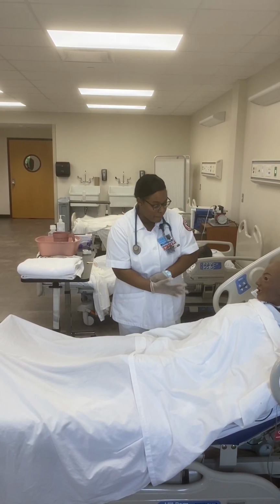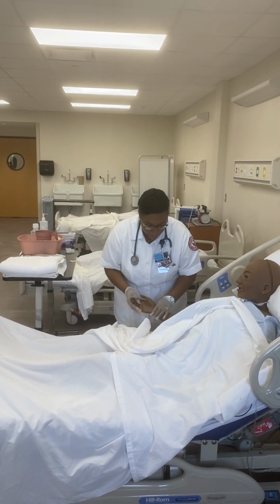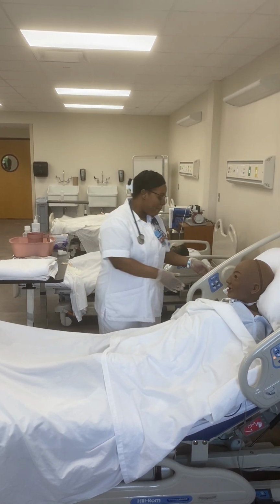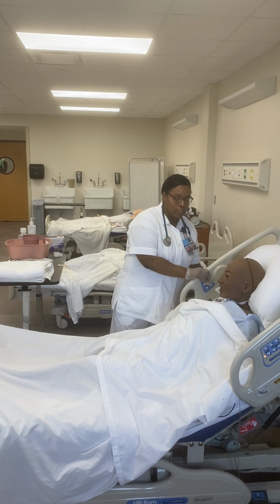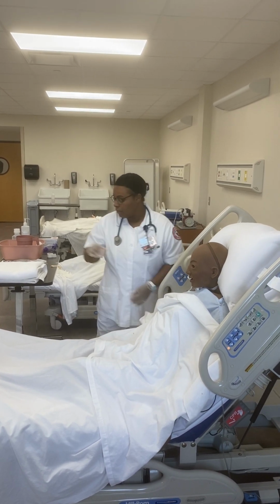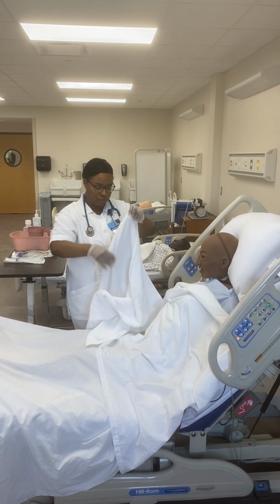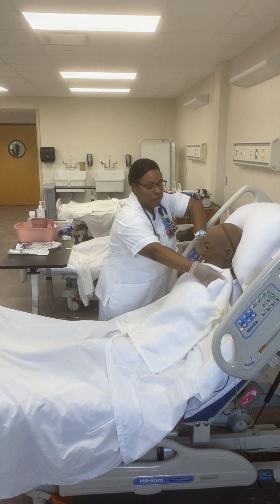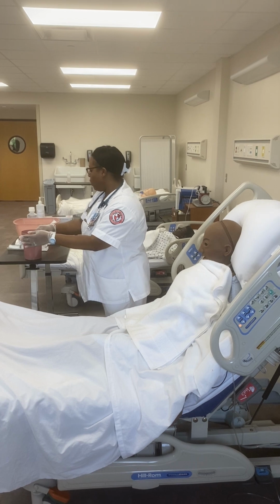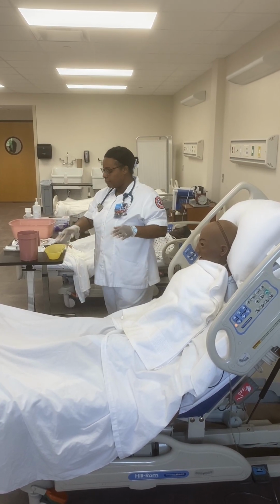All right, so I will verify my patient by checking the armband and asking them to state their name and date of birth. I will position my patient into high Fowler's position. Drape my patient with a towel. And have with me a cup of water, ice, an emesis basin, and tissues.